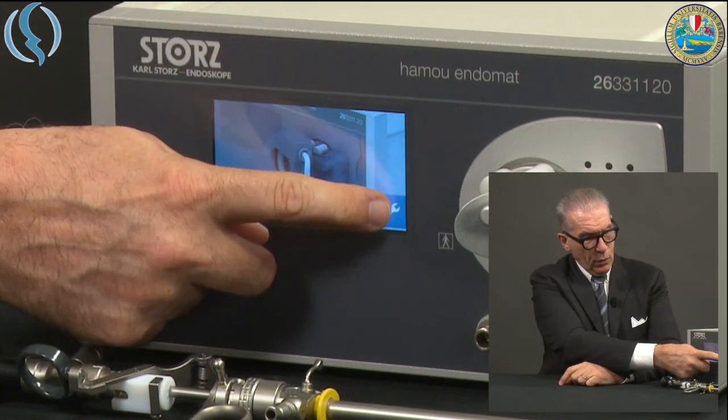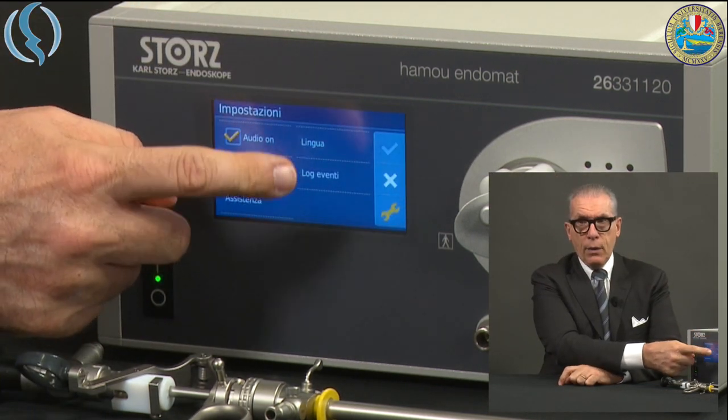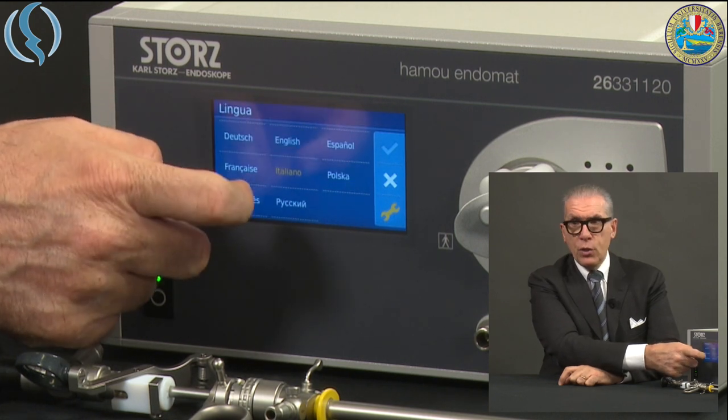We start as usual by switching on the device. The difference everybody can see is the presence of an LCD screen, which makes the pump more modern. After a short time of test, the pump will display a message suggesting to connect the tubing set. We cannot see or do anything different than the connection of the tube, except for a few regulations.